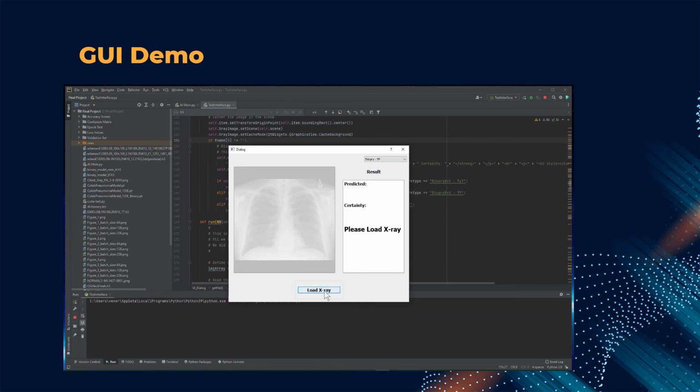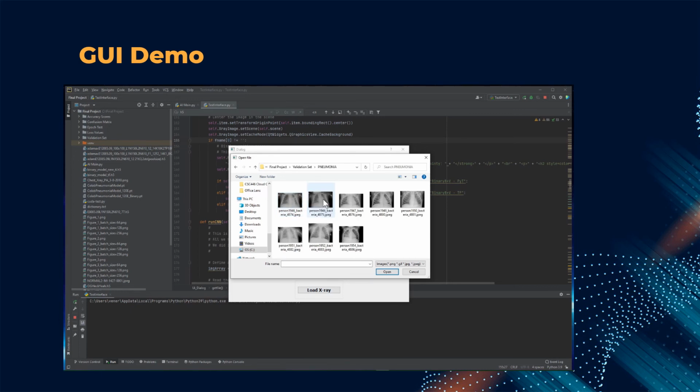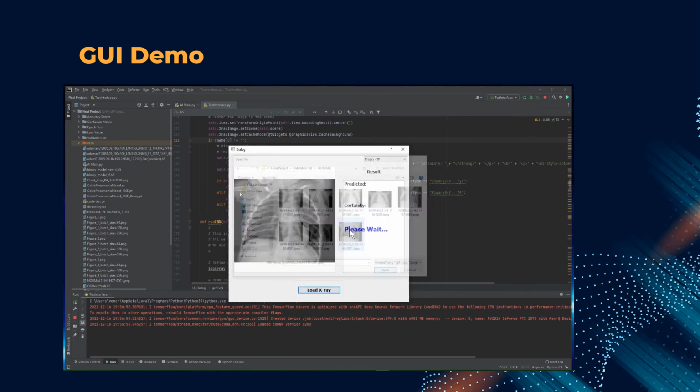Now, if the user attempts to load an image but cancels it, they'll be presented with this error message. Now, after successful loading of an image, the relevant network will start to load, and subsequent runs will also run on the same settings. So there is an initial please wait message there, but as I load additional images, the next image will load almost immediately.